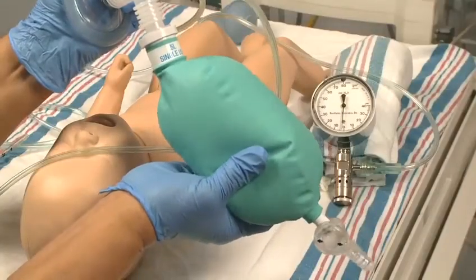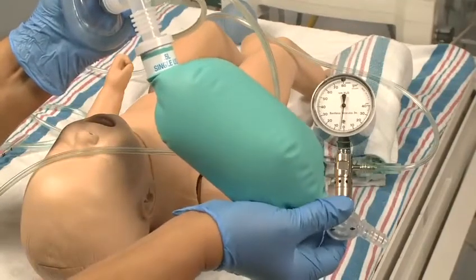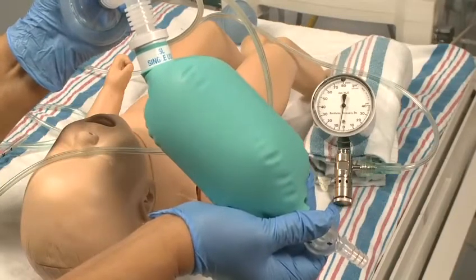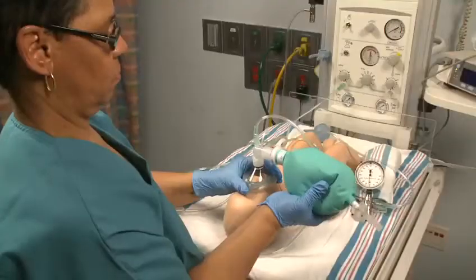Now, we'll set our inspiratory pressure by squeezing the bag and noting the peak inspiratory pressure on the pressure gauge. The peak pressure is adjusted by squeezing the bag. Further adjustments may be needed when you start to ventilate the newborn.